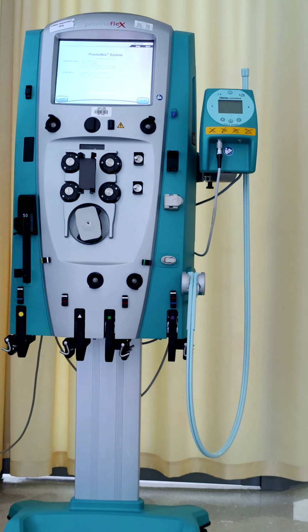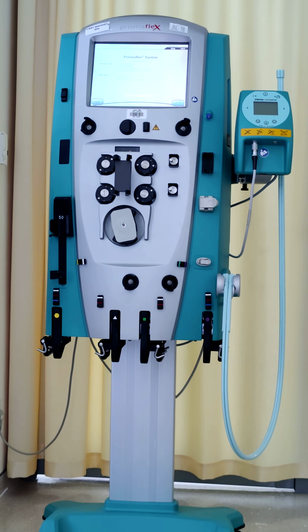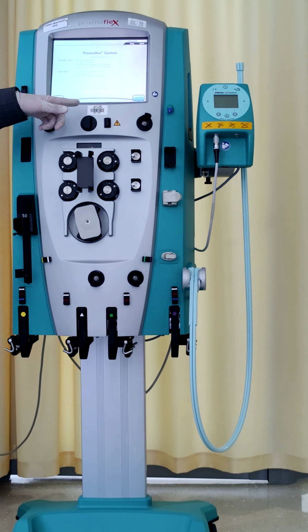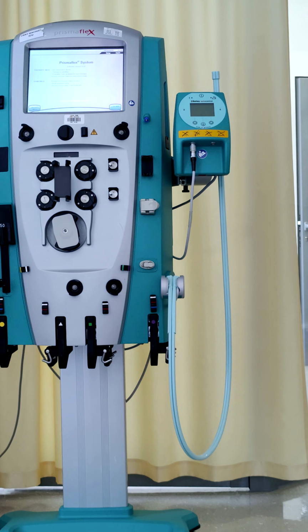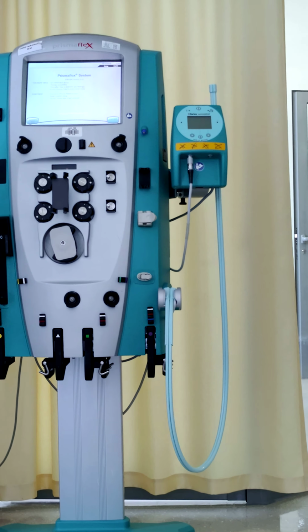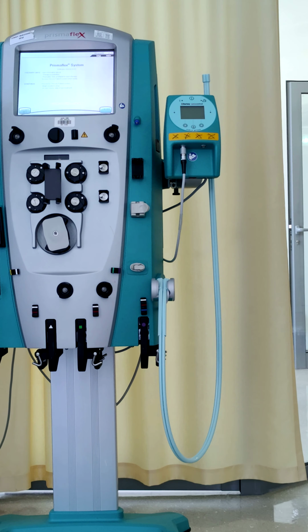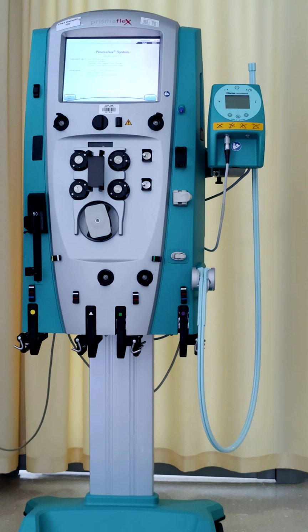One more thing, that balance amount without discarding, can we manually return it? After the machine gives us the alarm about the residual, you can continue and I will wait. I will stand beside the machine, change it back and put the other one. It will be very nice and will give us an efficient session without alarms, without anything. And the end user should be aware and understand what he is doing. Otherwise, you'll find strange alarms will come. We don't want to reach that, and your point is very helpful.